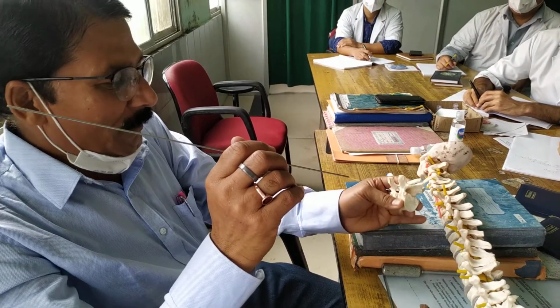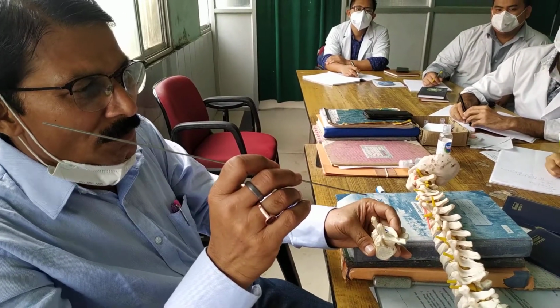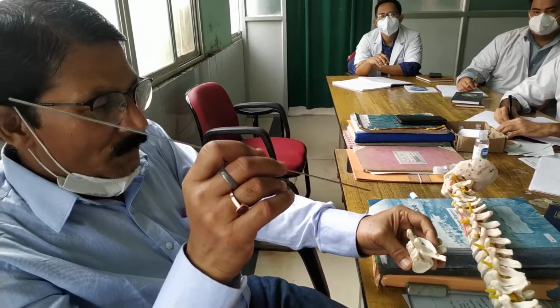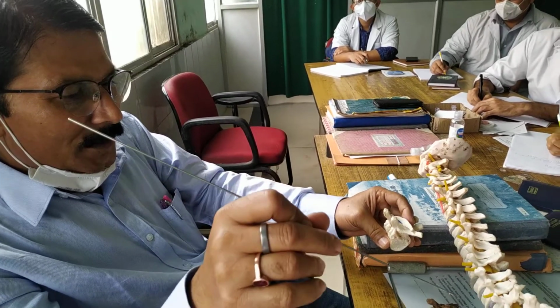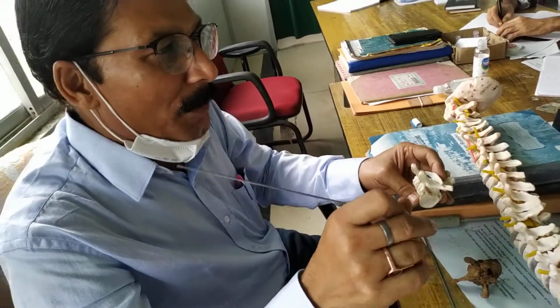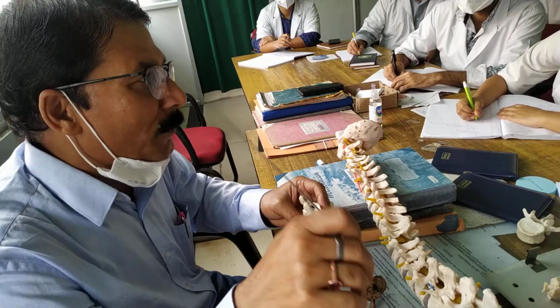Usually in the thoracic area, the size of the screw is around 4, 3.5 to 4. Most of the time it is around 4, and in the upper part almost smaller than that. Unlike in the lumbar area, where sometimes it is 5, 5.5, 6. And even in the sacrum, it goes up to 7 something.